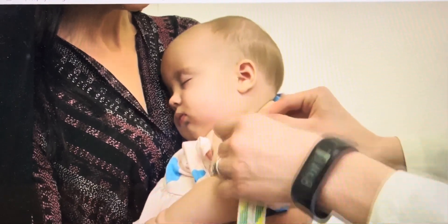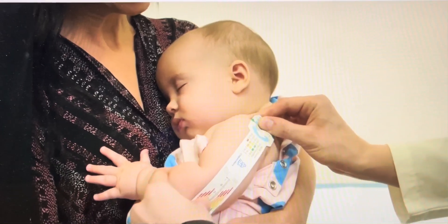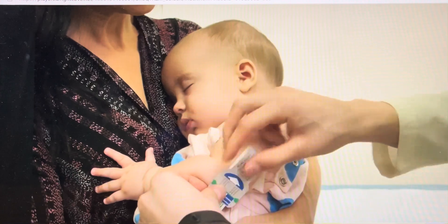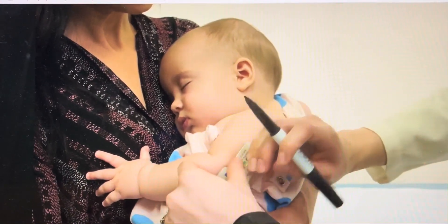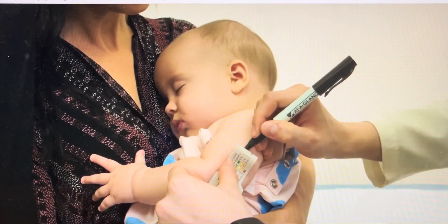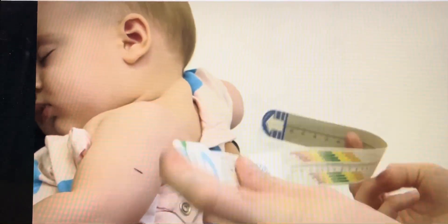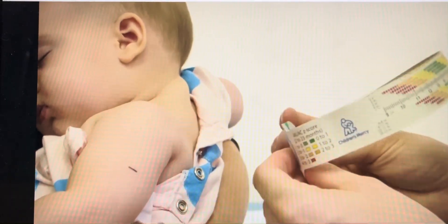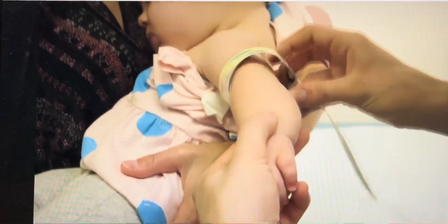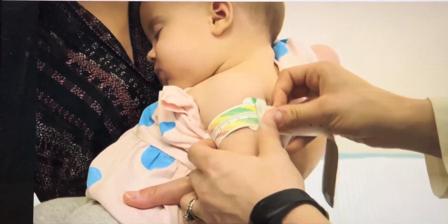You may encounter several differences when identifying landmarks and finding the midpoint on an infant. Firmer palpation may be required to identify the acromion process. The length of the infant's upper arm may be too short to identify a midpoint on the tape. If this occurs, simply fold the tape in half and mark the arm at the halfway point. Continue with the same process as an older child. The tape is made into a loop by inserting the tail end through the tabs, and the arm hangs loosely while the tape is pulled snugly so that it sits atop the mark made for the midpoint.